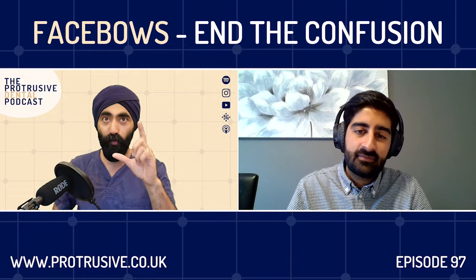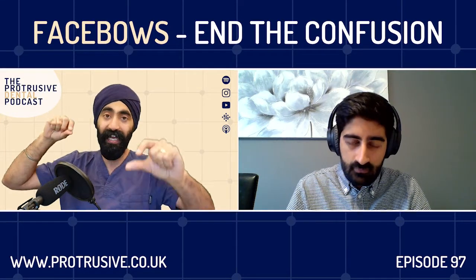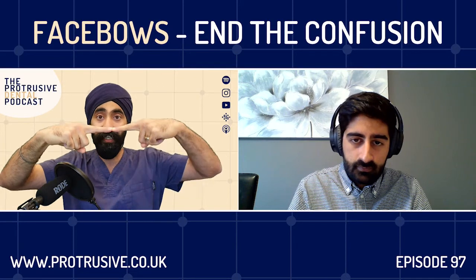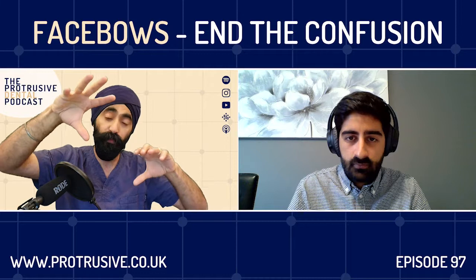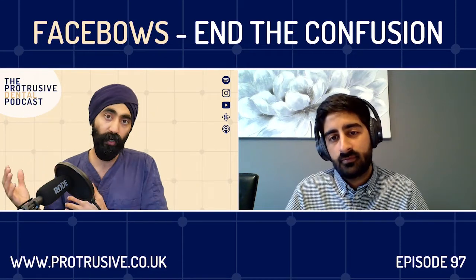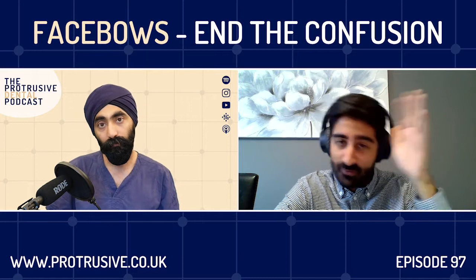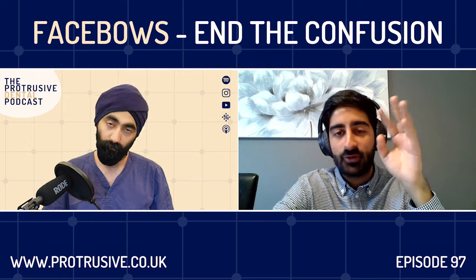So you've got your microbrush in, and now you wait for the material to set, the lab gets that, and then the lab is able to figure out that, okay, as long as this microbrush is completely parallel to my countertop, I know the situation of the models is going to be closer to the real life situation. Yeah, and it's important to note that they're not going to be mounting these casts at an aesthetic angle rather than a functional angle. We'll talk about it later anyway.